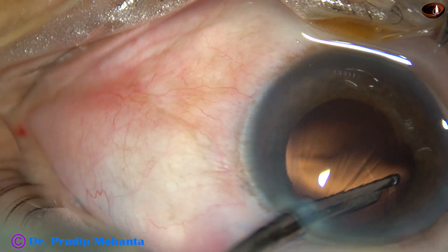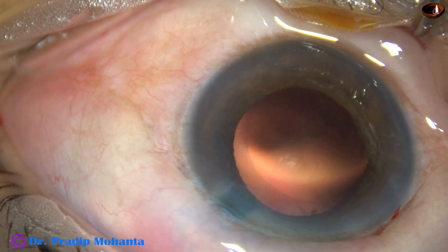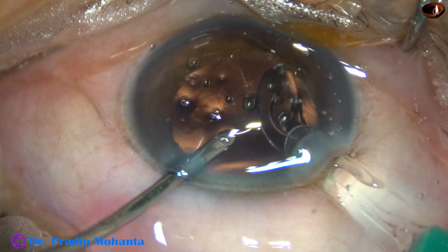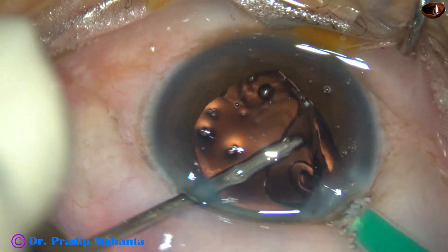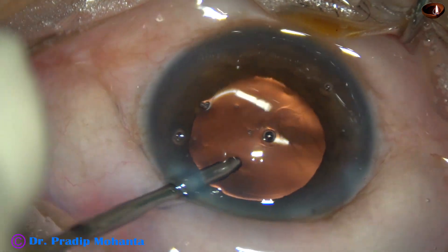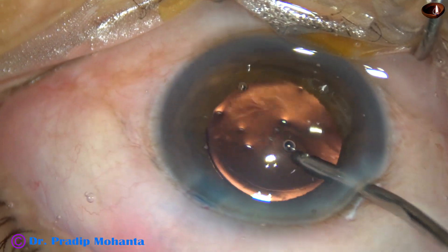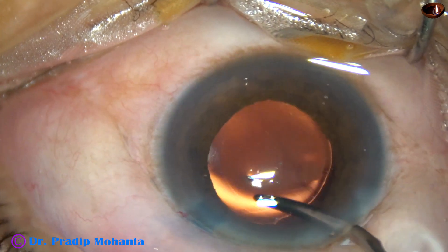After cortical cleanup, a hydrophilic acrylic single-piece monofocal intraocular lens is implanted, keeping the anterior chamber formed by irrigating fluid — this is known as hydro-implantation. The irrigating probe itself is used to dial the lens.